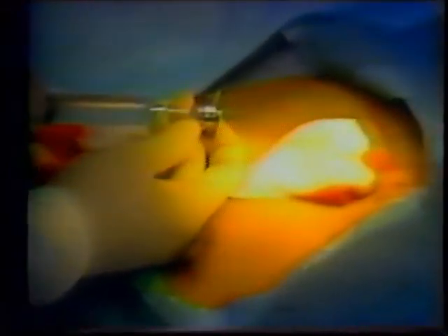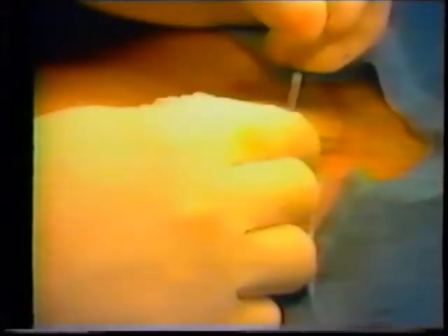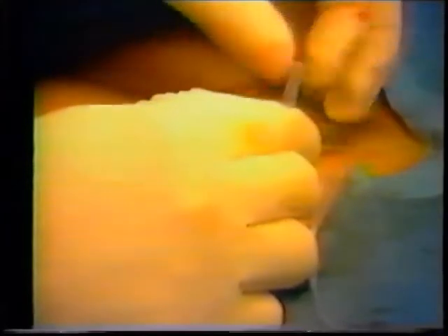Using the straight non-coring needle provided, flush the port holding the outlet stem upward, making certain all air is flushed out. Leave it saline locked. Slide the locking sleeve mechanism back up on the catheter. Slide the catheter onto the port outlet stem until it abuts to the port housing. Take care not to kink the tubing. Sometimes gauze provides superior grip. If the assembly doesn't work and the outlet stem or sleeve is damaged, discard the port and use a new one.